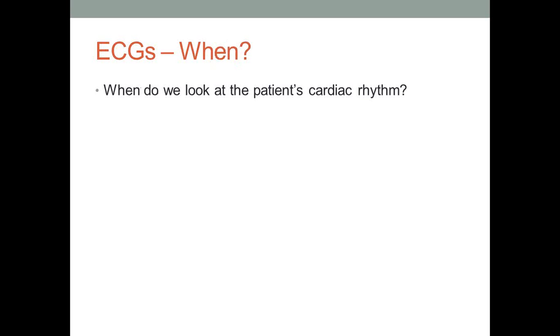And so when do we take these ECGs? There are some patients that you'll determine are too sick to fiddle around on scene and take an ECG. And that's great. There are some patients that are too sick that you need to load and go. Perhaps this is something you do in the back of the truck instead of on scene. Most often, you'll walk in on scene, and as the attendant, you'll start asking all the right questions, and your partner will have hooked up oxygen, the cardiac monitor, got you a set of vitals, maybe started packaging the stretcher, getting things ready to start moving, and you'll have to look over at the monitor and determine what it is you've got.